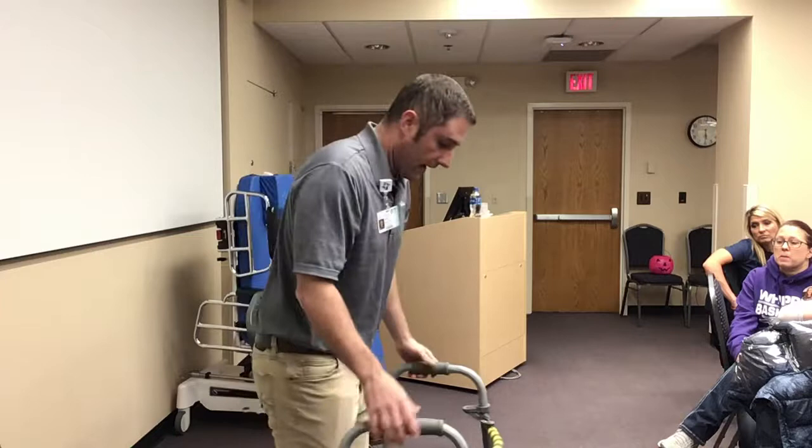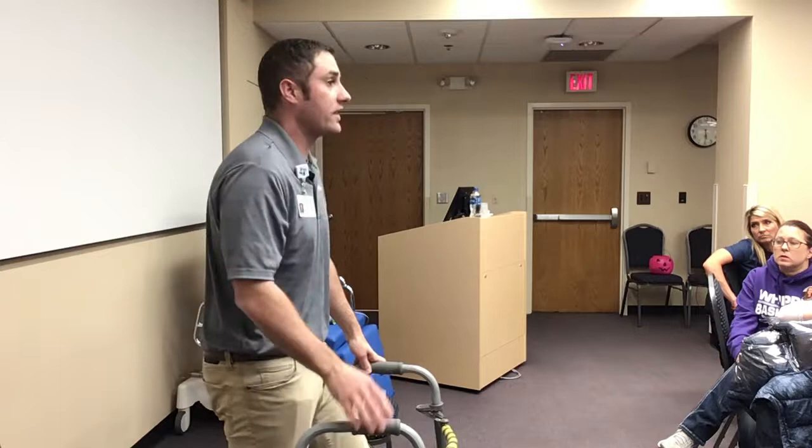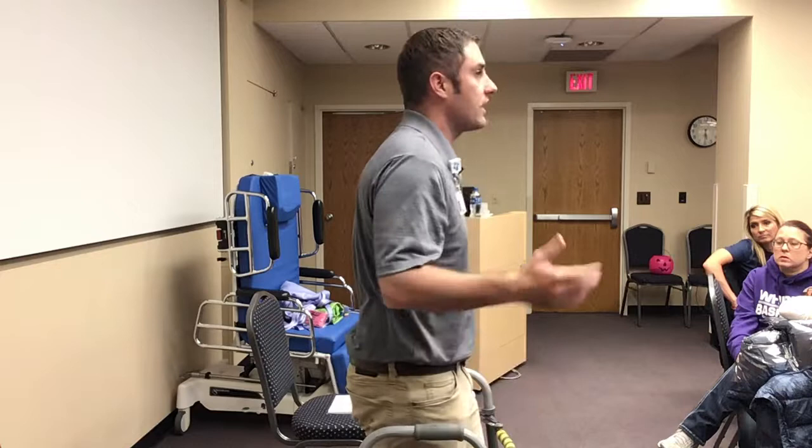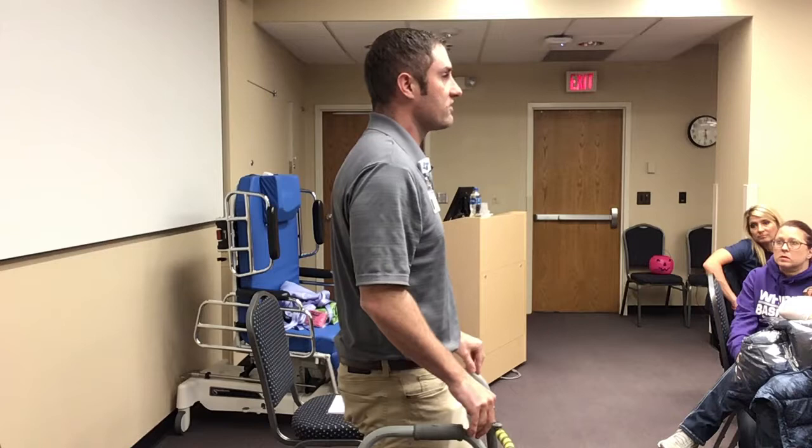Non-weight-bearing status means you can't put any weight on the leg. It's best to have that leg hanging out in front of them, set the walker ahead 6 to 12 inches, and then have them use their arms to swing forward. They can maintain a non-weight-bearing status with this walker even though it has wheels on it — it is safe to do with this device.